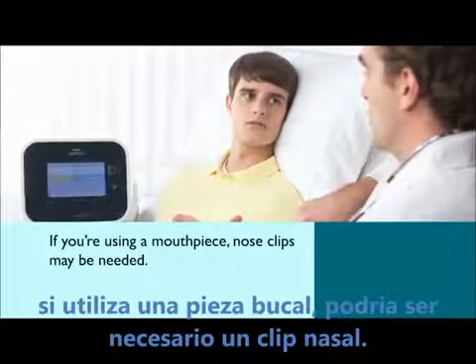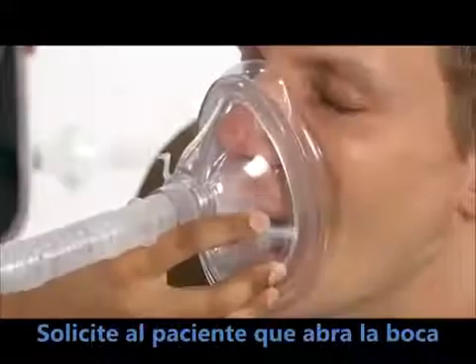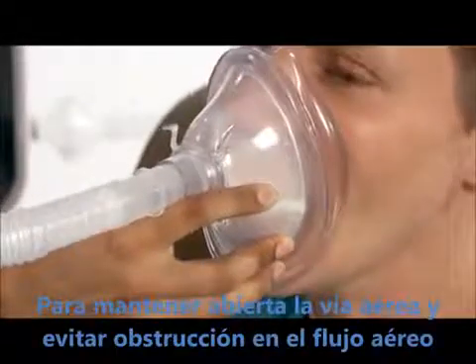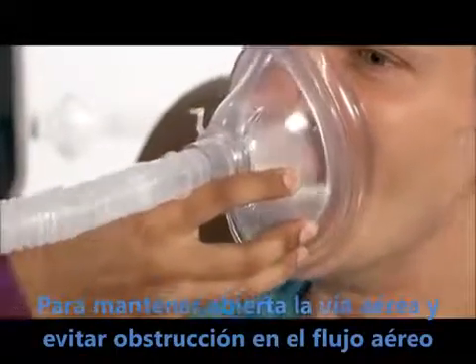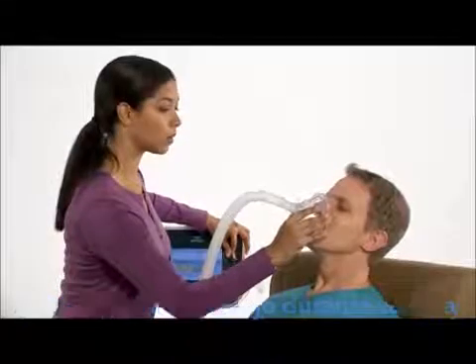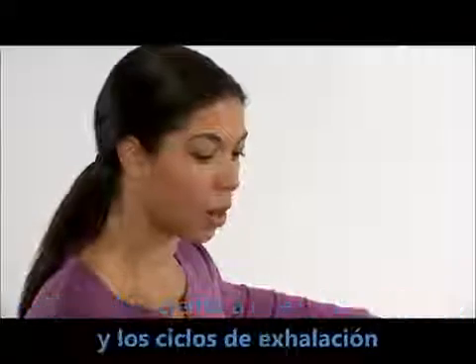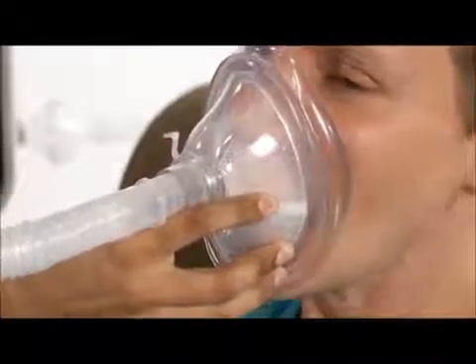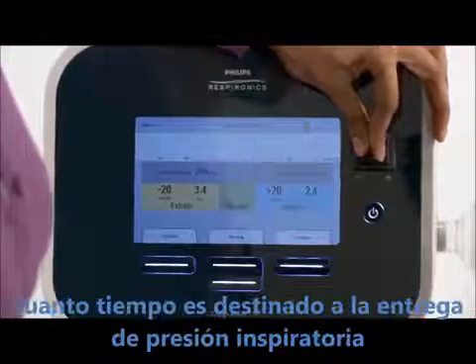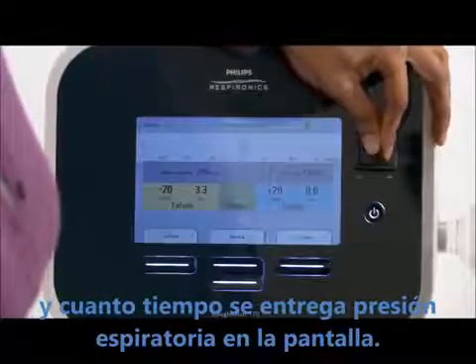If you are using a mouthpiece, nose clips may be needed. Instruct the patient to open his mouth and actively inhale during inhalation and exhale during exhalation, which will open the airway for unobstructed airflow. Ask him to keep his mouth open and tongue down throughout the therapy. Encourage the patient to be relaxed and passive during the inhalation and exhalation cycles. When providing a treatment in manual mode, you can see how long you are delivering the inspiratory pressure and how long you are delivering the exhaled pressure on the screen.